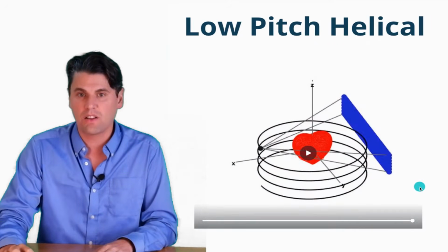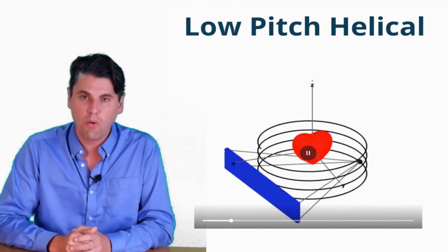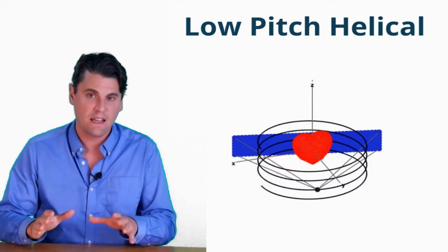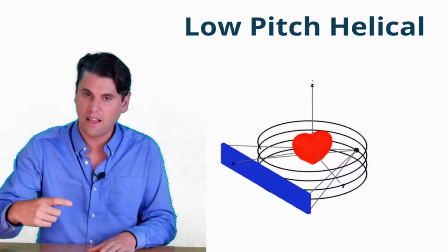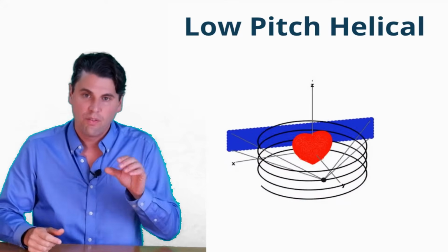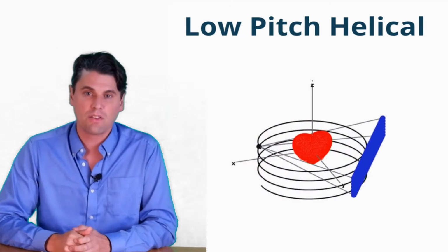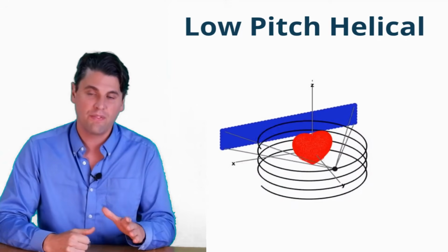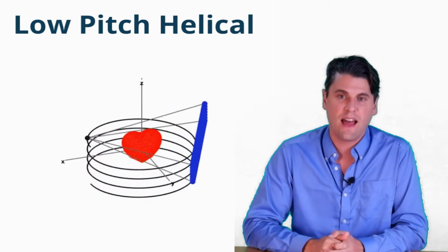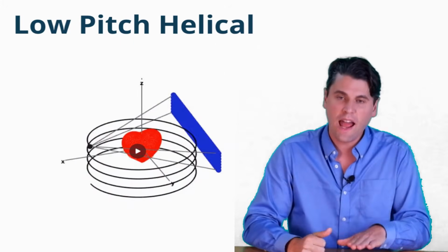So you can do reconstruction, which is very similar to axial reconstruction for this low pitch helical data. In that scenario, you can do gating, like we talked about, getting essentially a short scan of data, and you can do that such that for each slab of data, you will be able to reconstruct at the same cardiac phase.